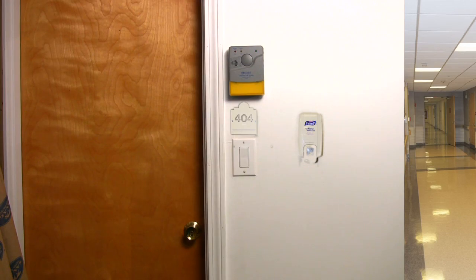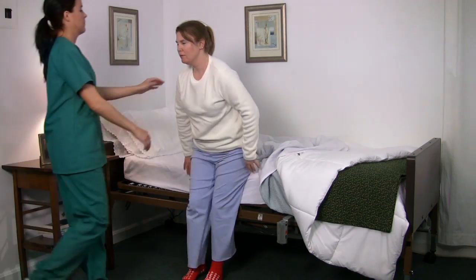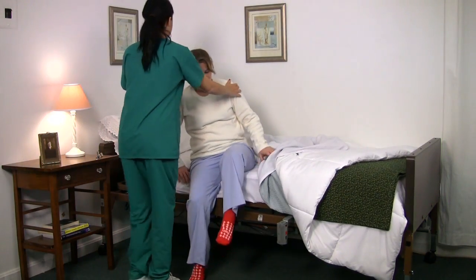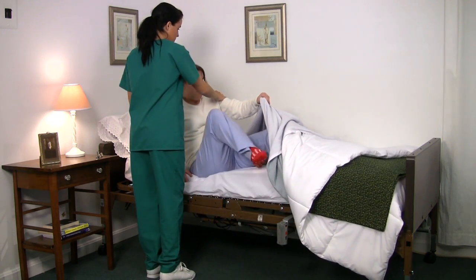Now when your patient rises and breaks the beam's path the alarm will sound immediately both at bedside and at the remote receiver unit. This gives the caregivers ample time whether nearby or around the corner to attend to the patient who is now in danger of falling. Be sure to test your system daily to ensure proper function.